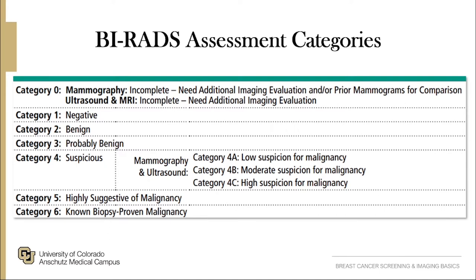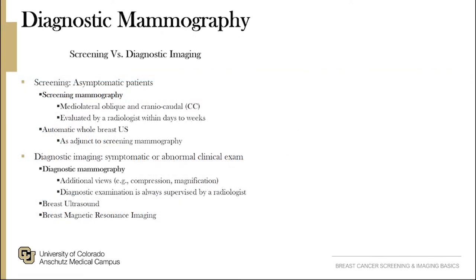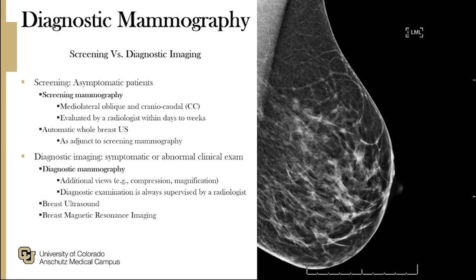Our patient's screening mammogram was notable for microcalcifications found in her left breast. Her mammogram was assigned a BI-RADS category 0, and therefore she was recalled for additional imaging. Diagnostic imaging, such as diagnostic mammography, is performed in women or men who present with breast complaints or have an abnormal clinical examination, and in women who have abnormal screening mammography. Patients with specific breast symptoms, such as a palpable lump, nipple discharge, or focal pain, should undergo diagnostic mammography.